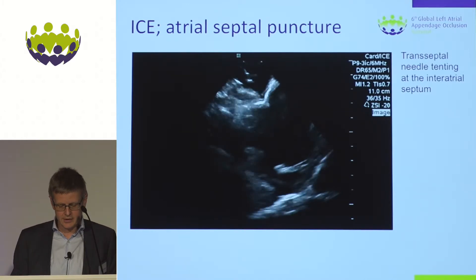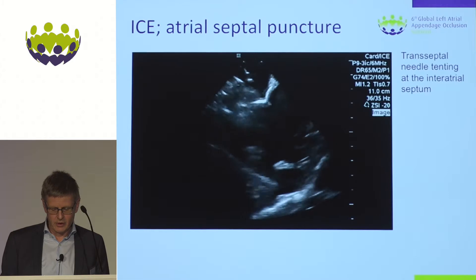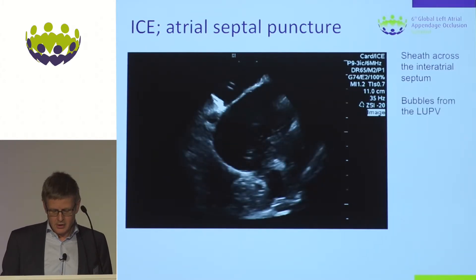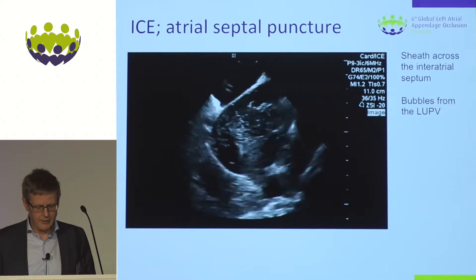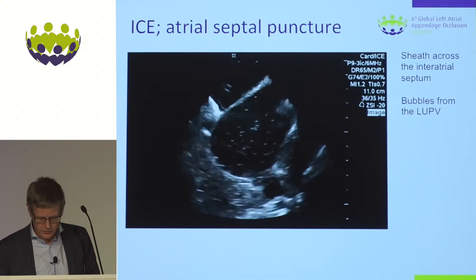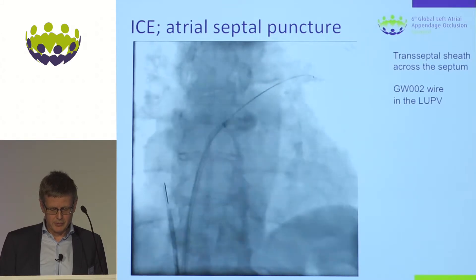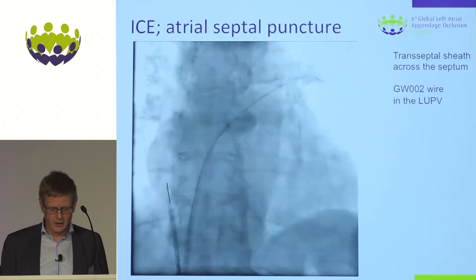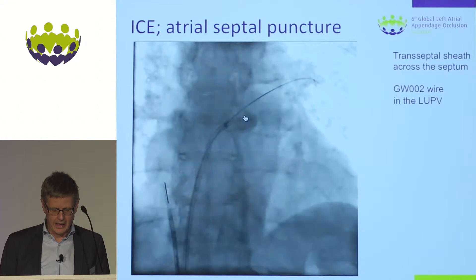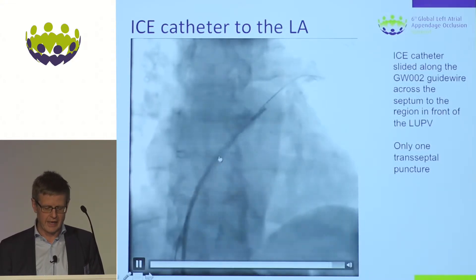It is easy to see when you are on the septum with your needle and confirm safe tenting for a safe transseptal puncture. You can rotate around to look at the anterior aspect or use fluoroscopy to confirm posterior orientation. Once the transseptal sheath is in the left atrium — confirmed by saline injection creating bubbles coming from the left upper pulmonary vein — the next step is to advance the ICE probe into the left atrium using the guide wire as a pathway, sliding the ICE catheter through the same defect created by the transseptal puncture.